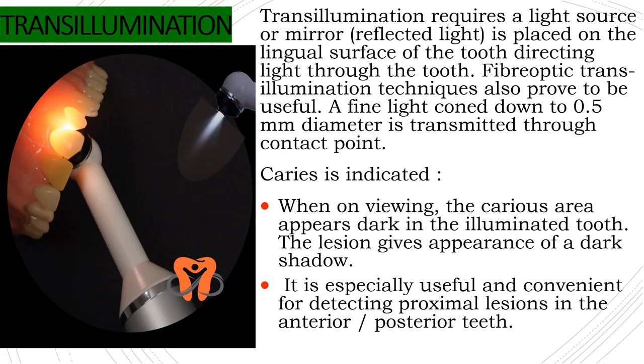Transillumination. It requires a light source. Now, this light source can be a mirror whose reflected light is placed on the lingual surface of the tooth. Fiber optic transillumination techniques can also be used. Now, what happens in this technique?